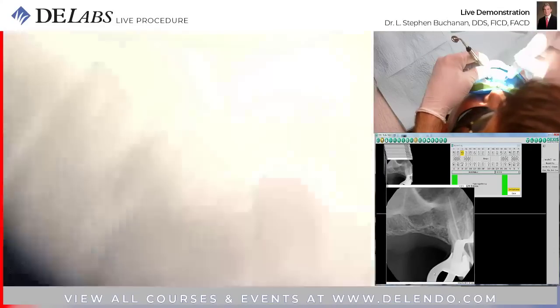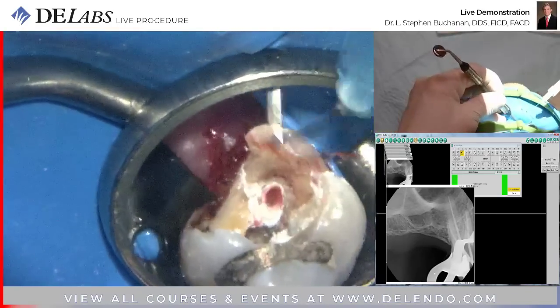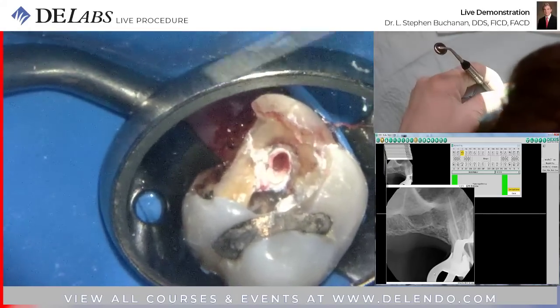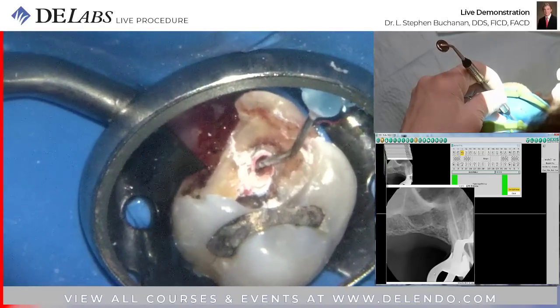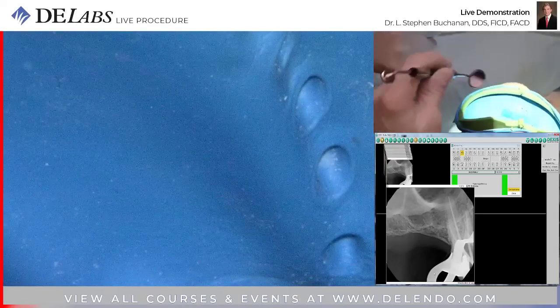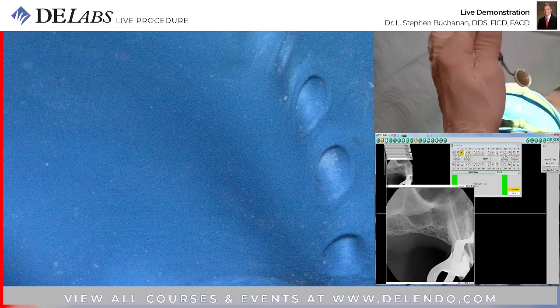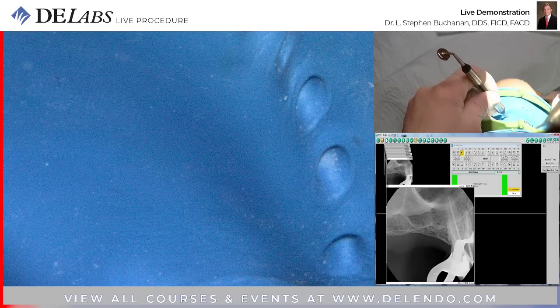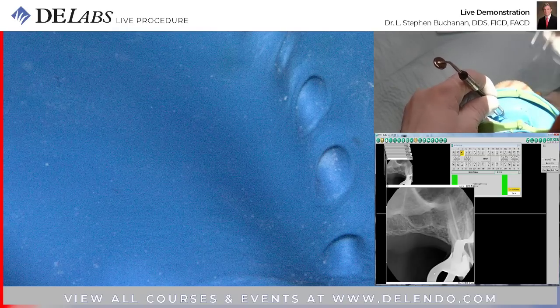Why are you doing that? That's a half down pack. I'm going to take the sealer. I'm going to take a backfill cone that's an 08. It's exactly the same size as the plugger. Plugger leaves an impression in the gutta percha.